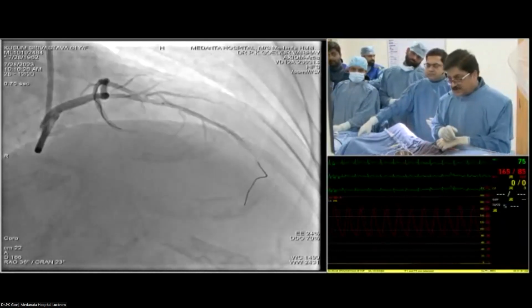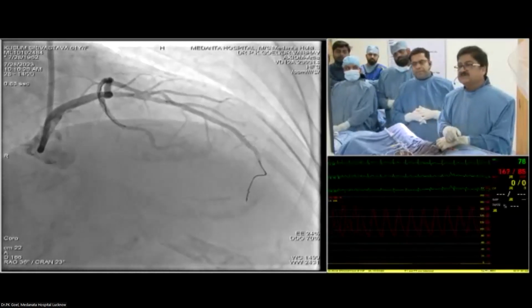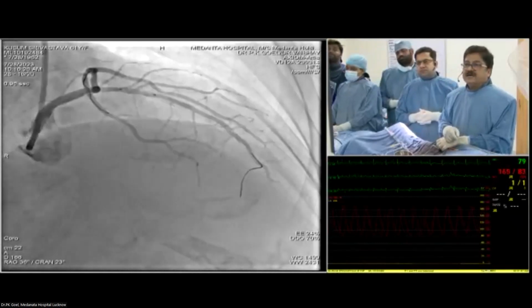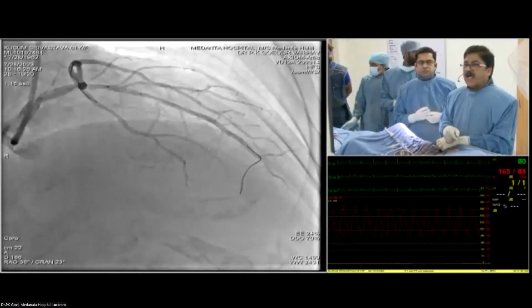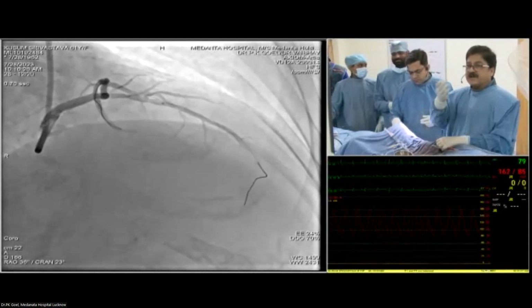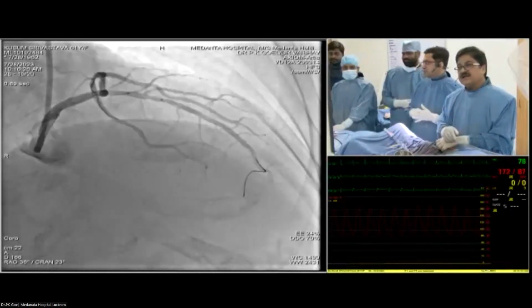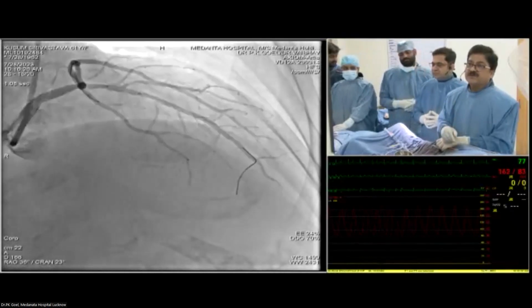So the stent, now the distal LAD, as I measured, is only about 3.3 or something. And the left main is certainly 4 or 4.2. With this, one strategy sometimes that I do is have a 3.5 and expand it to 4 in the left main. But here it is a little longer and 3.5 for that distal LAD segment may not be good.